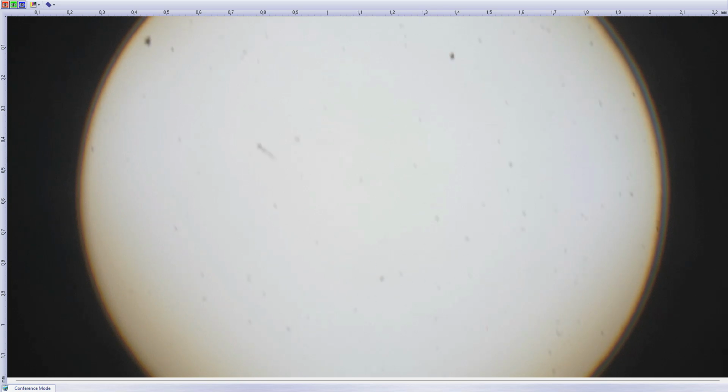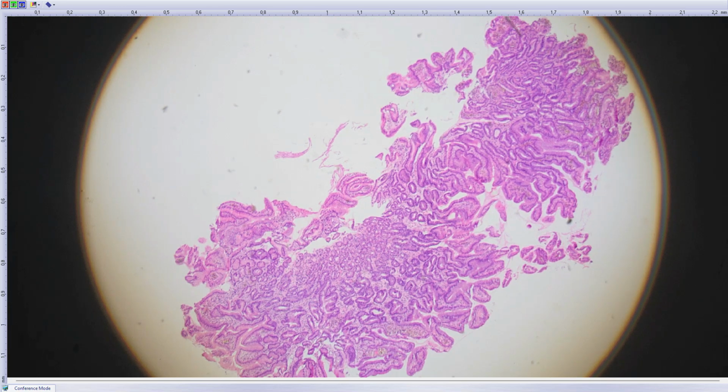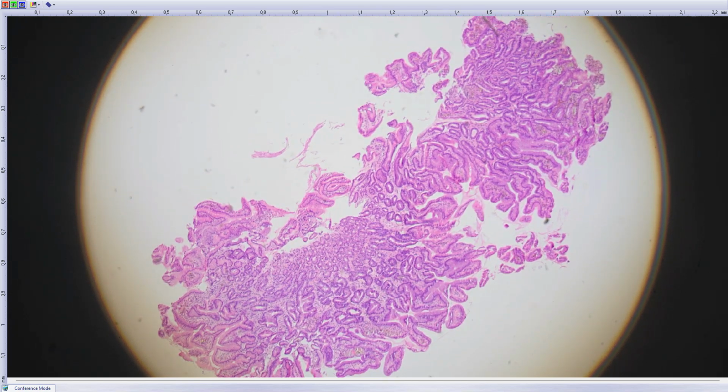I've got today a couple of basically very simple basic pathology cases. The first case is a biopsy from the stomach of an 80-year-old male with a clinical history of anemia, and they are investigating why the gentleman has got anemia. So they have taken GIT biopsies.